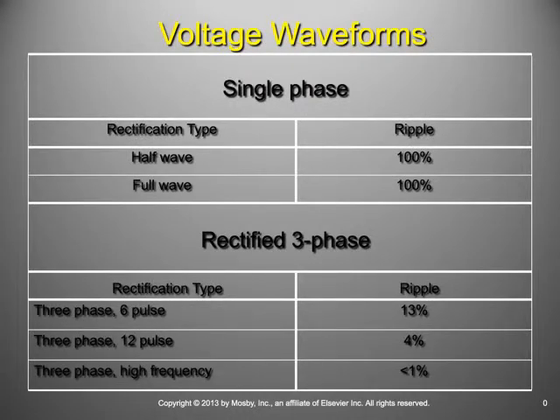Now, bear in mind that when I talk about this crazy rainbow of energies, we are trying to minimize that rainbow as much as possible. We don't want a really crazy rainbow being made. And so that's what we talk about when we talk about rectifying the power to the X-ray tube. We are going to need to flip it over a series of conversions so that it doesn't ripple too much. The more it ripples, the bigger and the crazier that rainbow is going to be, right?